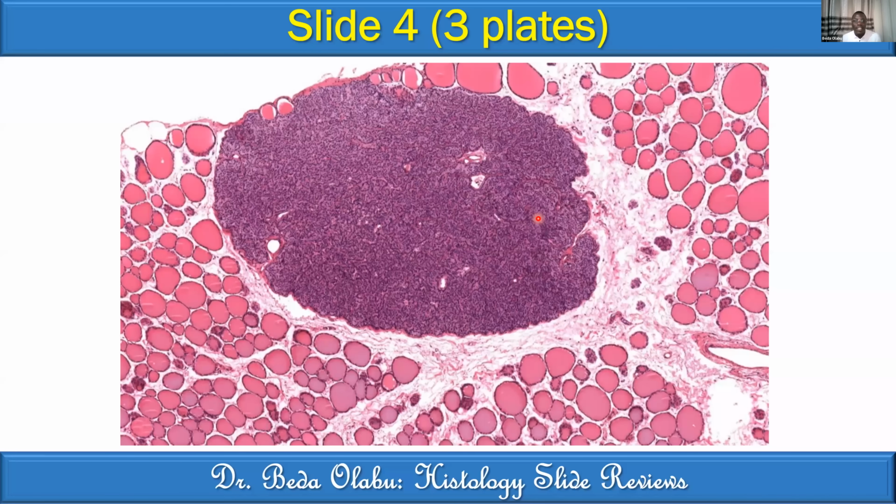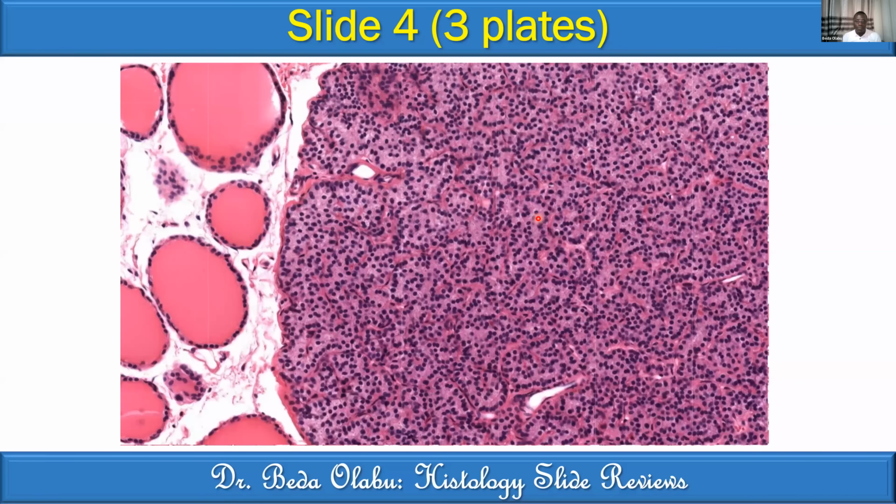And then that is the second level magnification. So again, capture what is standing out for you at that magnification. Remember, we are focusing on this one. And lastly, that is the third level of magnification and the last one.